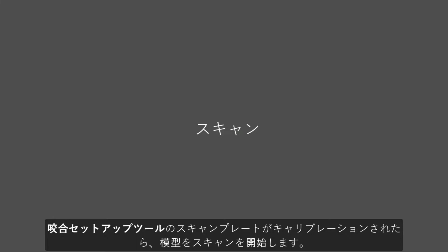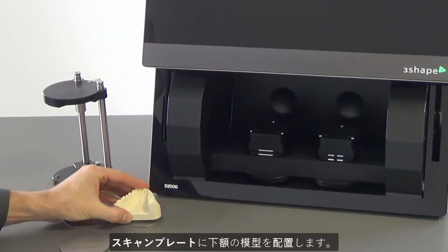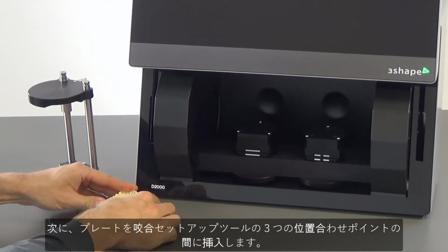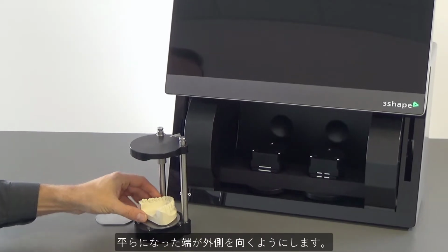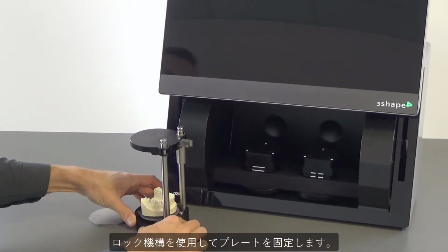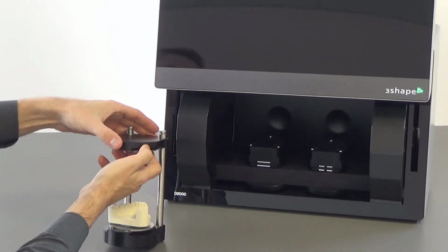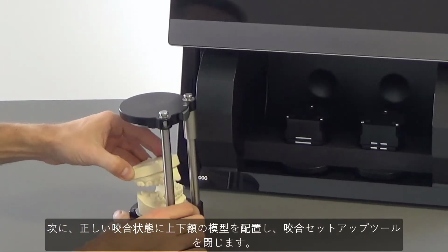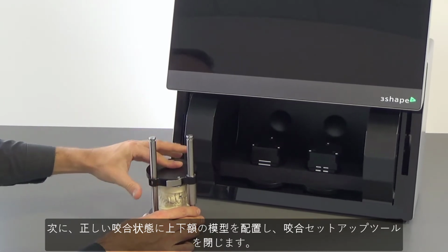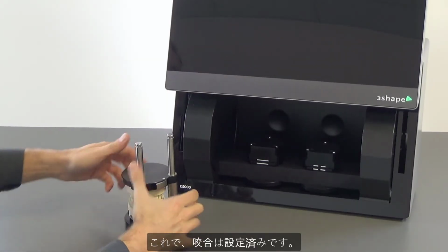When the Occlusion Setup tool interface plates have been calibrated, you can start scanning models. Start with setting the lower model on the interface plate. Then insert the plates in the Occlusion Setup tool between the 3 alignment points. The flattened edge should be facing outwards. Lock the plates using the locking mechanism. Now position the upper model on the lower in the correct occlusion and close down the Occlusion Setup tool. And now the occlusion has been set.